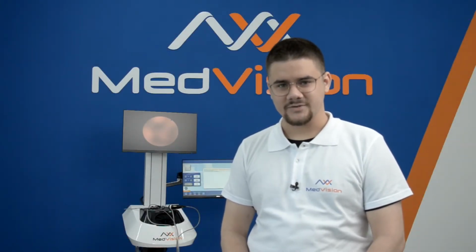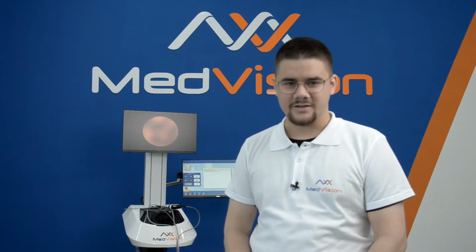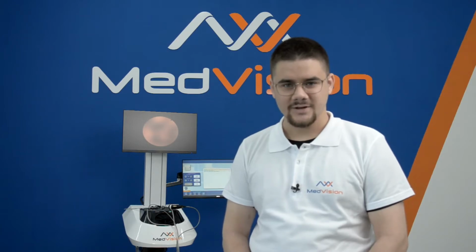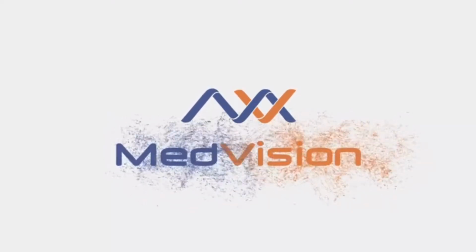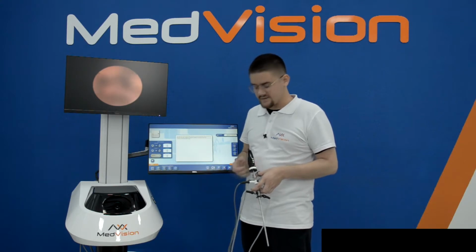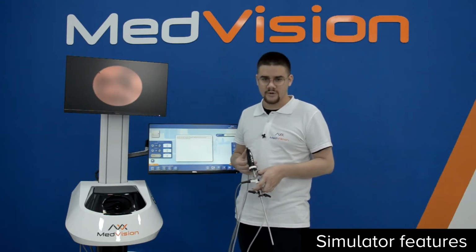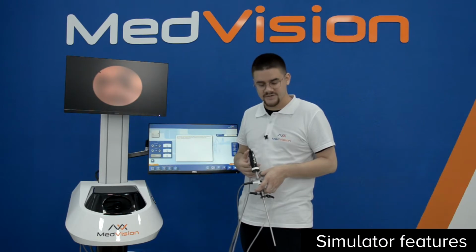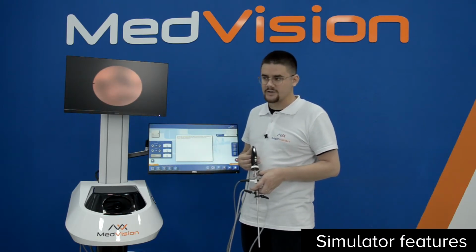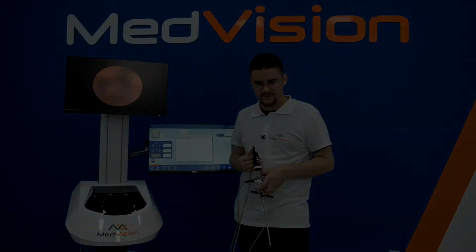I'm the Pre-Sales and After-Sales Director at MedVision Europe, and in this video we would like to show you our hysteroscopy/TURP simulator, HystVision. The HYST/TURP Vision Simulator is a standard platform like we use with our lap vision, endovision, angiovision, and other simulators. It's going to be very similar to those simulators, so in this video we are going to be including shots from the lap vision simulator.